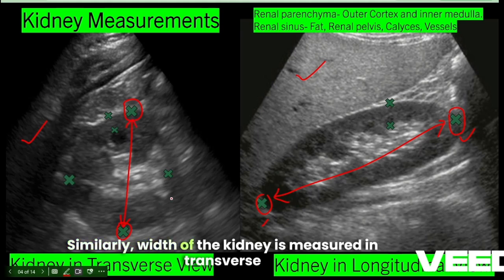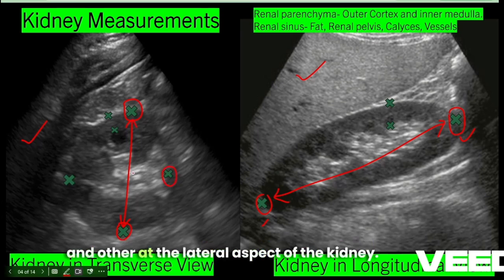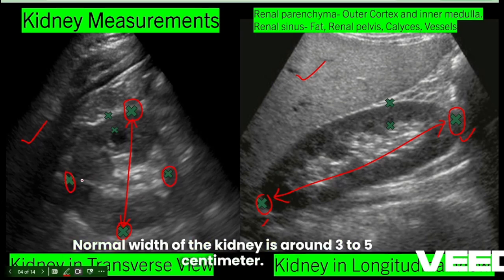Similarly, width of the kidney is measured in transverse image by putting one caliper at the medial aspect and other at the lateral aspect of the kidney. Normal width of the kidney is around 3 to 5 cm.